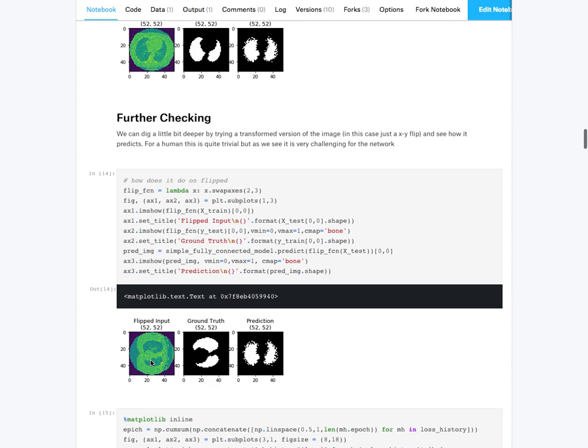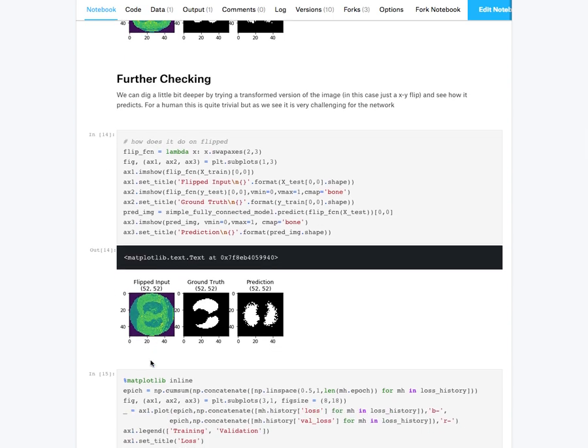So rather than having a method that has actually learned what lung is and how to identify it in pictures, you have a method that simply memorized these regions most of the time belong to lung and spits out those results.